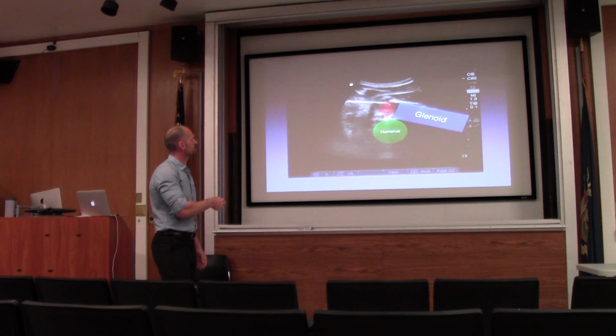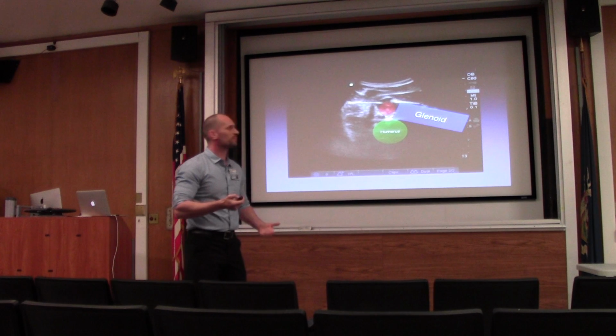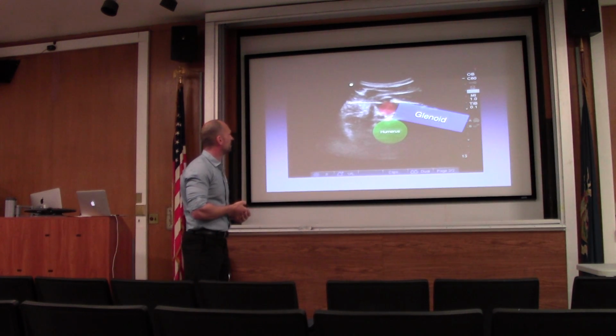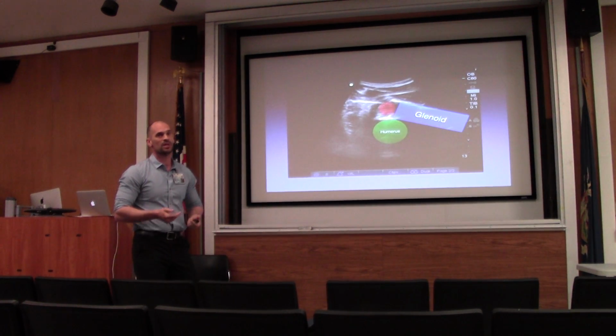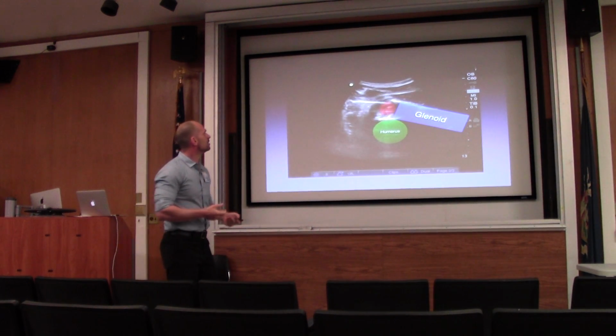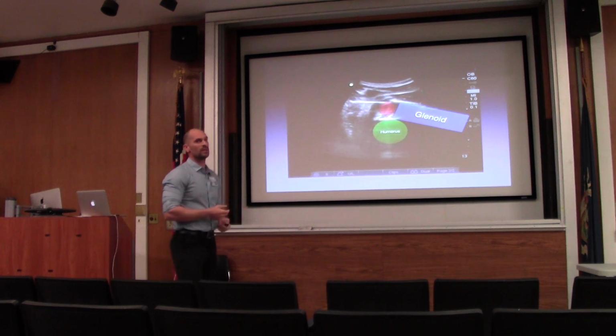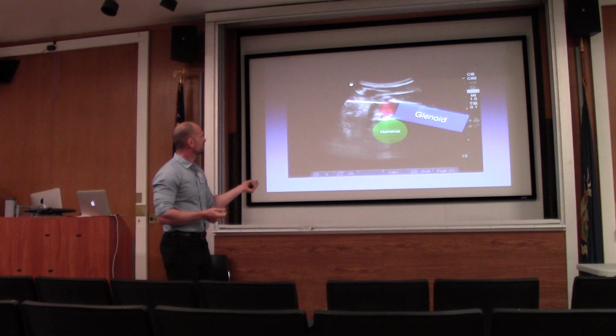Then you're going to be able to visualize the actual lidocaine going in. I think there shouldn't be a huge amount of discrepancy about the dose of what you should be doing. Usually I use 1% lidocaine. I never use epi when I'm injecting a joint. I don't think you want to cause any kind of vasoconstriction around that area, so these are always without epi. I usually use about 20 cc's, with the spinal needle coming into the glenoid.